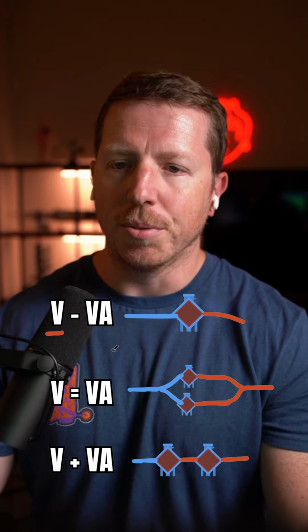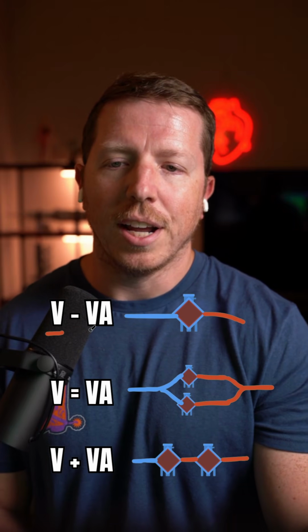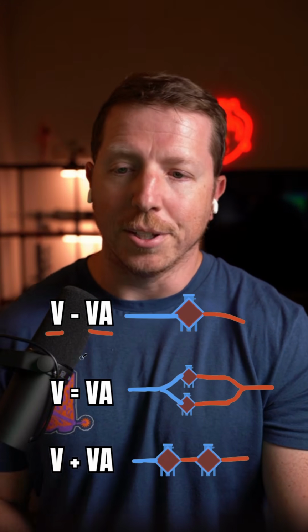The next thing is the middle symbol. So right here, just one line, one dash here, that represents the oxygenator. There is one oxygenator in this circuit. So we have the oxygenator, and then on the other side, we have our return cannula. So in this case, we have a venous and arterial return cannula.